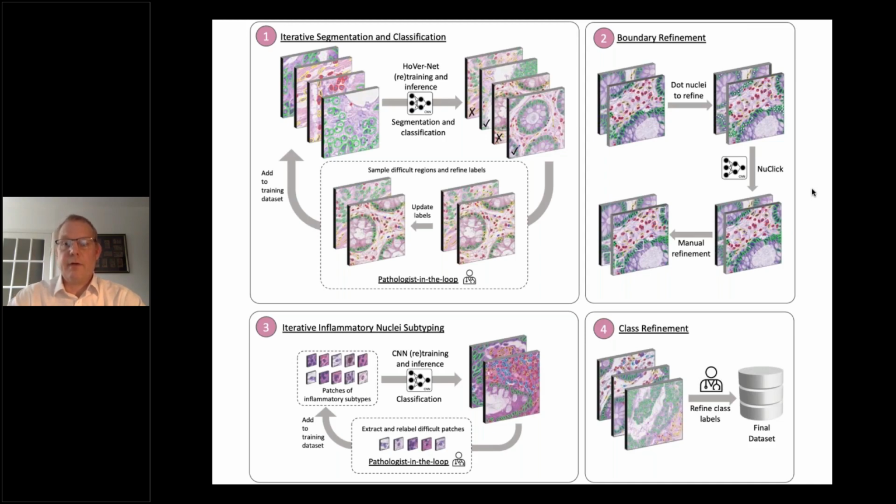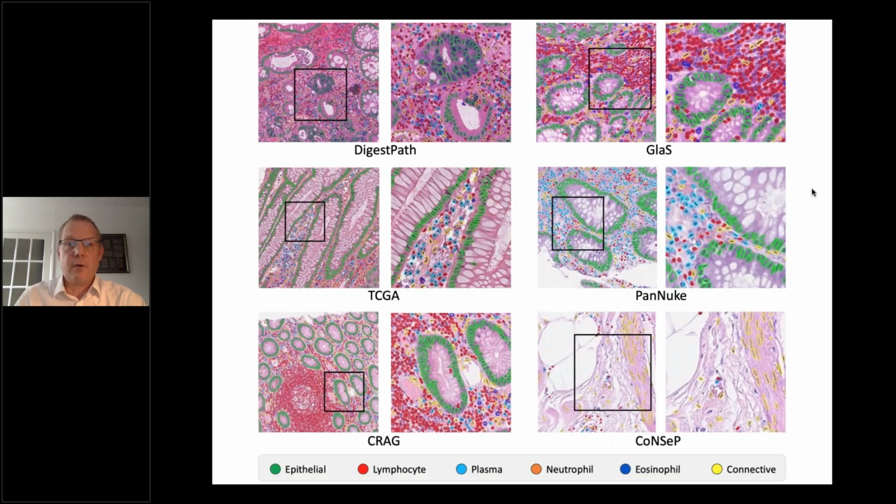And that can lead to a very successful tool which can automate not just the annotation of normal glands, as I've shown, but right down to cell levels. So this is the latest iteration of its cell marking tool, which we've been working on in PathLAKE, which has great accuracy in recognizing different cell types in large bowel mucosa and indeed in submucosa as well.